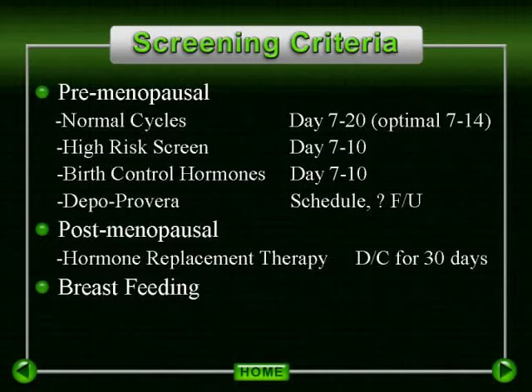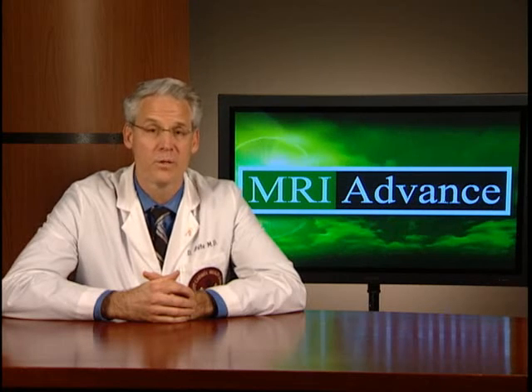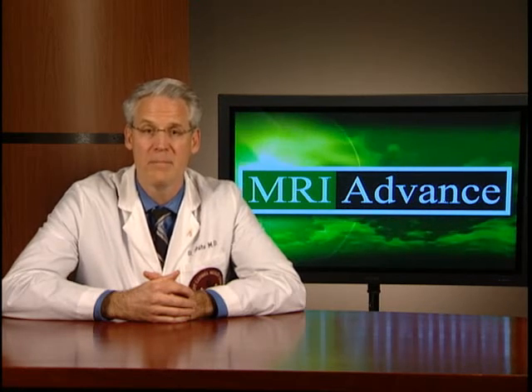In women who are recently postpartum and breastfeeding, we will attempt to delay imaging for at least 3 months after cessation of breastfeeding. There has been literature, however, demonstrating that invasive cancer is still detectable by MRI during breastfeeding. Obviously, if there is a palpable mass or strong suspicion of disease, we will proceed immediately with MRI imaging. We are fairly stringent with our scheduling criteria relating to variations in hormone effect on the breast parenchyma because we have seen firsthand how hormonal effect can significantly hinder interpretation of the exam.